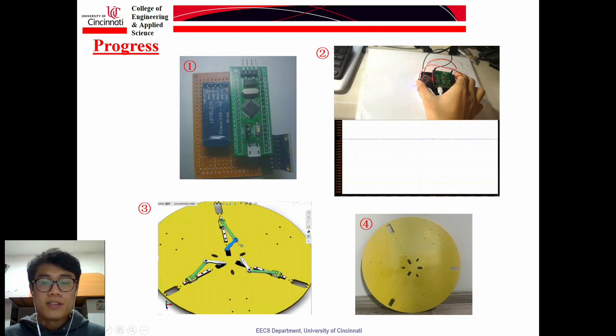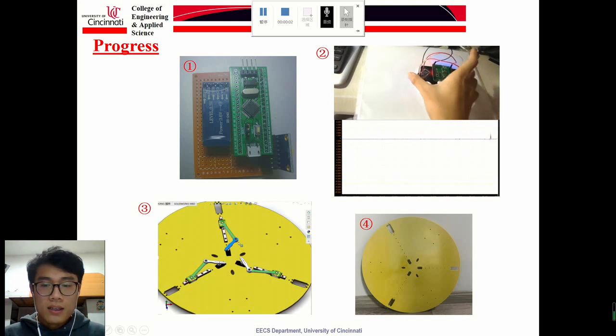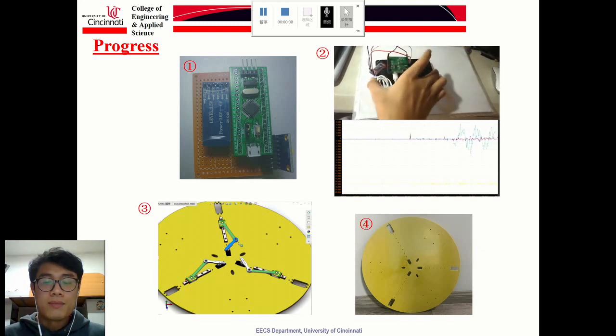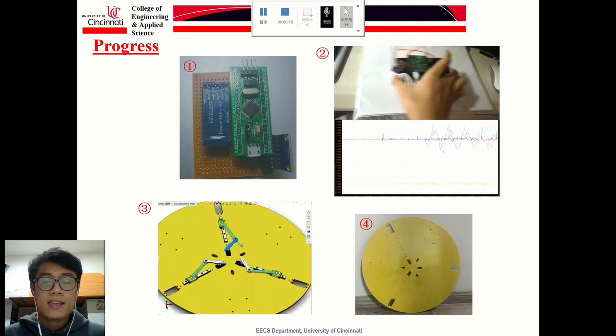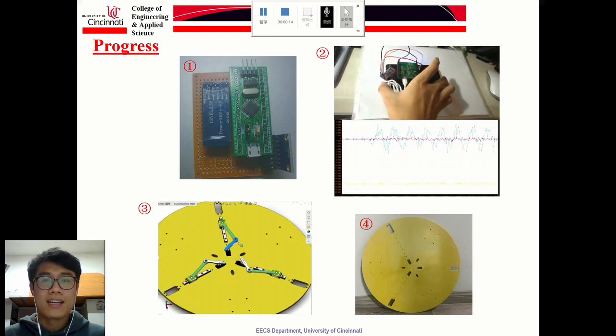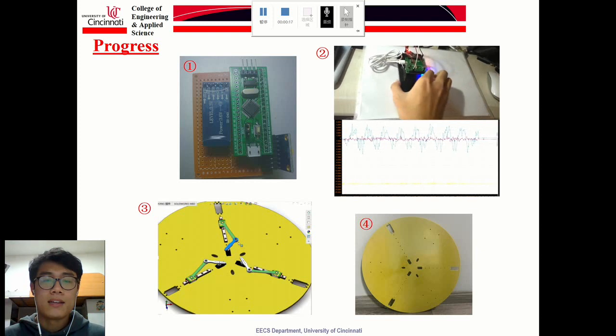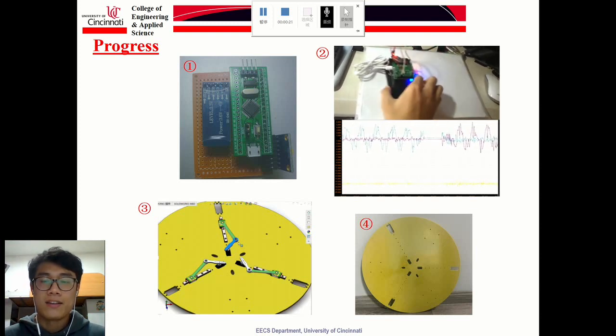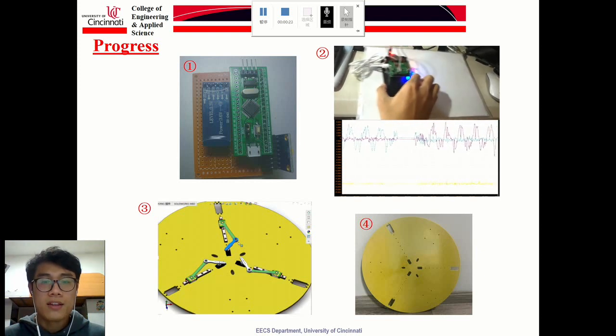The second video shows the test process. When I shake the device, it can get acceleration data and transmit it to the PC. And the figure below is the received data. There are 3 acceleration components, and when I change the direction of shaking, it can detect the acceleration in another direction.